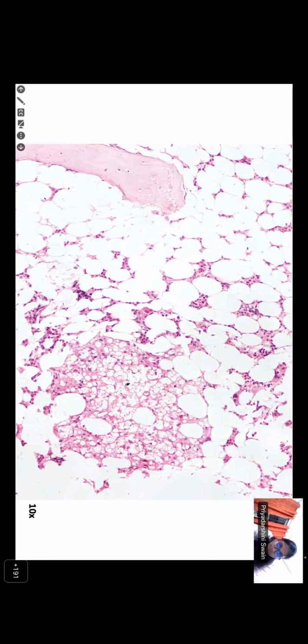Anybody else? Dr. Priyadarshini, can you come in? Clusters of foamy cells. Okay, clusters of foamy cells, somewhat vacuolated appearing. So probably Taranjyoti is interpreting these as adipocytic cells. Most of the adipocytes are larger until the time they become atrophic and rounded off. Then you see a mucinous change, a gelatinous transformation, when the fat atrophy occurs. The cells become very small, rounded off, with some pink material also. So this is a nodular collection of histiocytes, correct? And most of these are quite vacuolated.